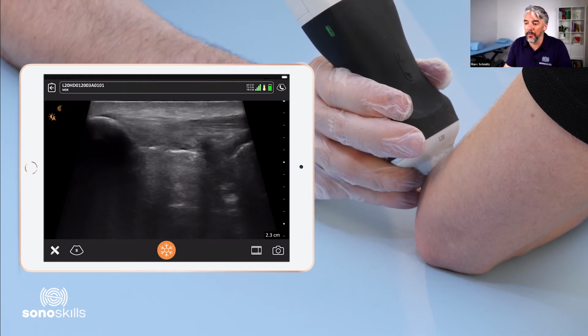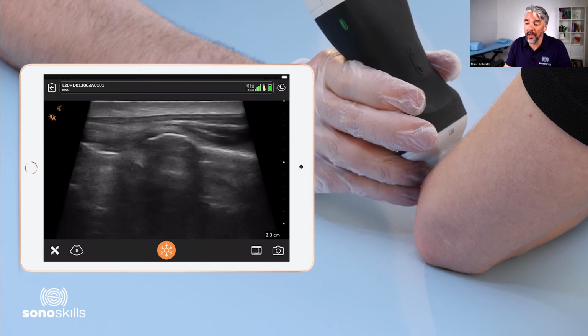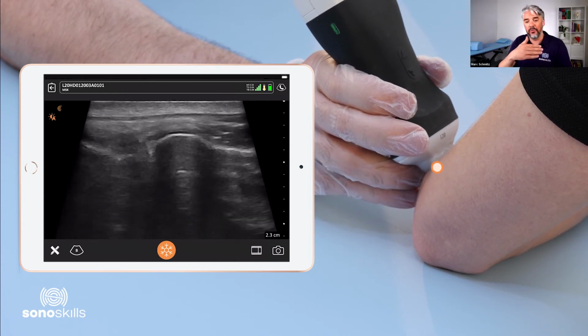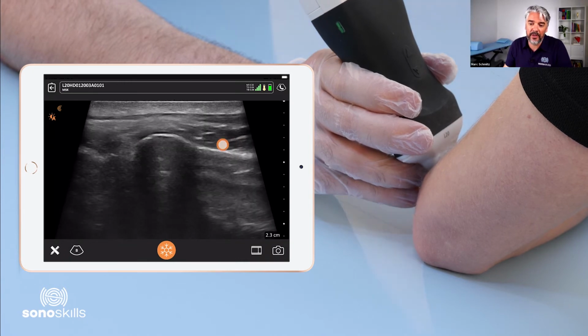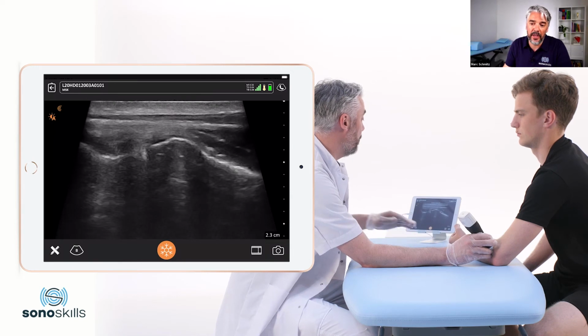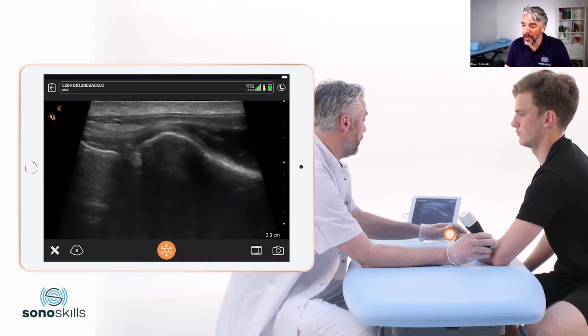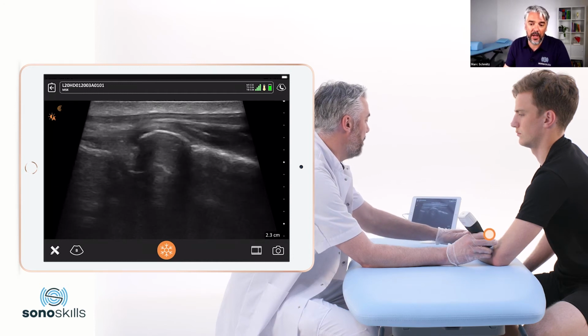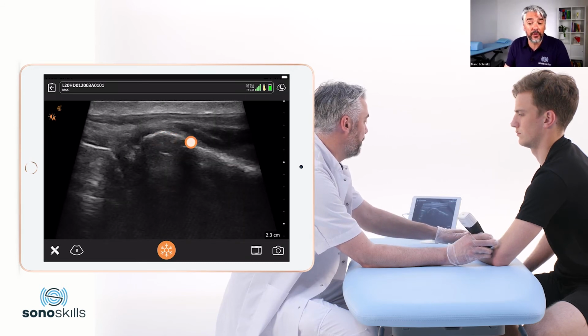It's important to scan in proximal to distal orientation, to scan every fiber of the tendon like this, but also in going down and up again, so that you have all parts of the tendon. Here we can see fiber orientation, which is a little bit different. This is the supinator muscle, and it's right underneath the extensor muscles right there. I'm going to hold the patient's hand and make a pronation and supination, as you can see, and this gives you a view on the radius pronating and supinating within the humeroradial joint. This is interesting to see whether there are bony changes due to osteoarthritis, due to degeneration, but also in case of suspected fracture, you could, of course, also pick it up right there.